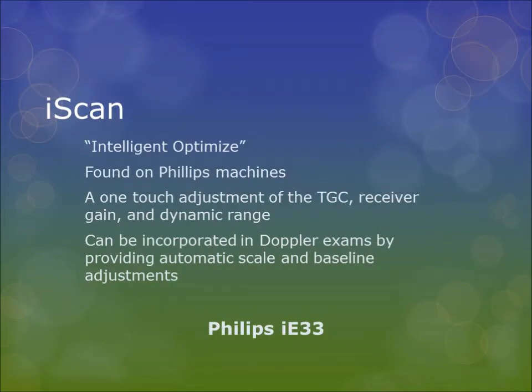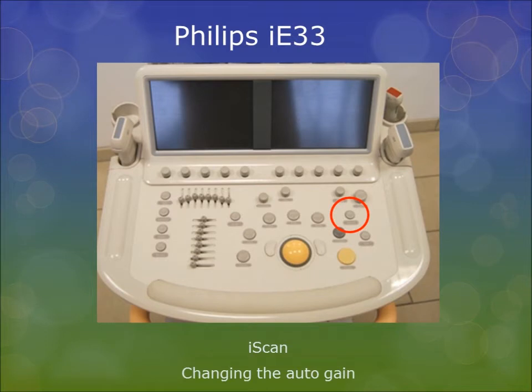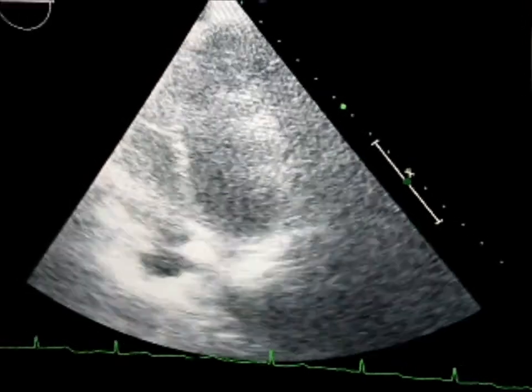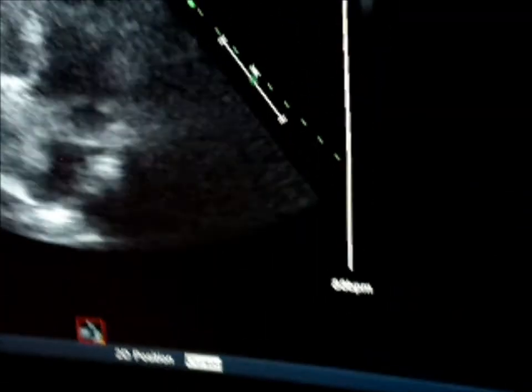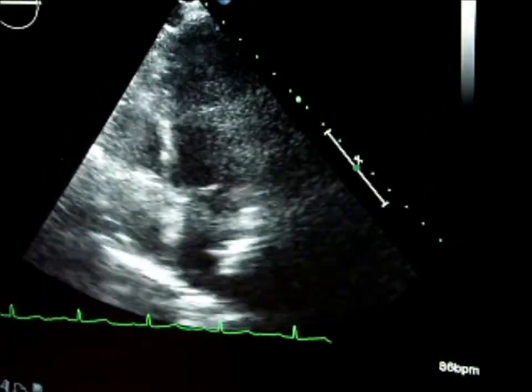iScan, or Intelligent Optimize, is found on the Philips machines. iScan is a one-touch adjustment of the TGC, receiver gain, and dynamic range, and can be incorporated in Doppler exams by providing automatic scale and baseline adjustments. Here is an echocardiographic clip from the apical window. As we begin imaging, the overall gain setting results in poor image quality. After iScan is applied, a decrease in overall gain can be appreciated. Please note that the artifact resulting from the patient's rib has no significance in the auto-gain setting.